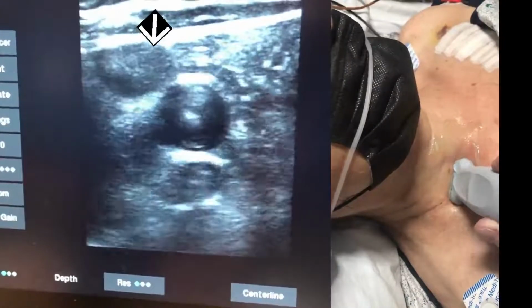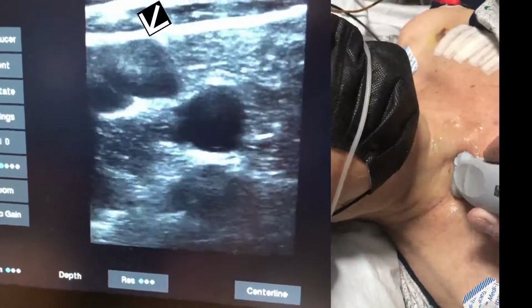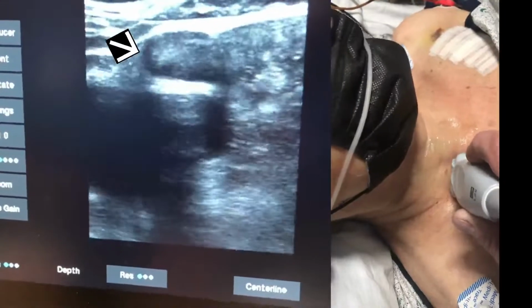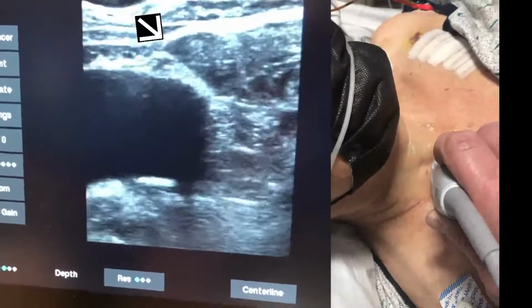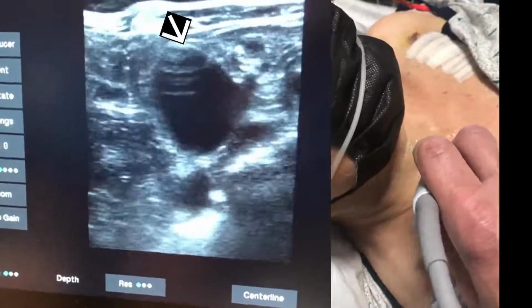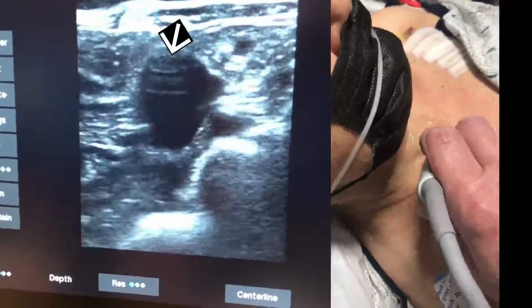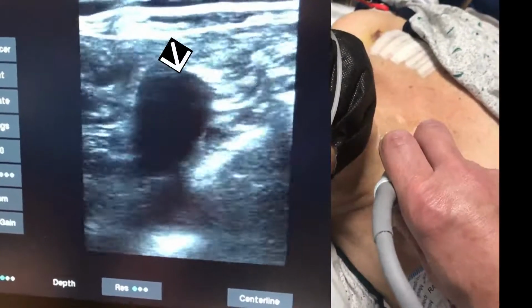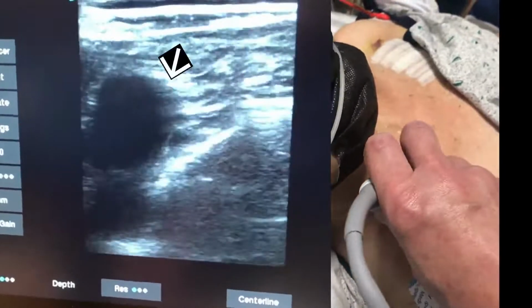Again, we're now just above the clavicle. See how close the vein is. So it's easy, if you're in a lower insertion, to go through the front wall of the vein, back wall of the vein, and get into the innominate artery in this patient if we weren't careful enough with the use of ultrasound. Using the ultrasound does not preclude that you can puncture the artery if you're not following the tip of the needle.